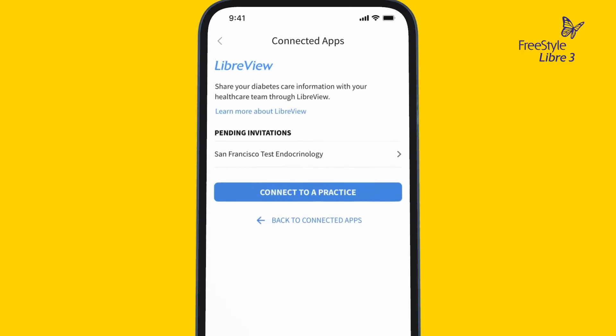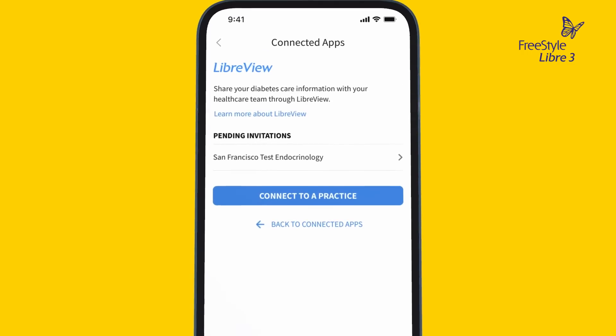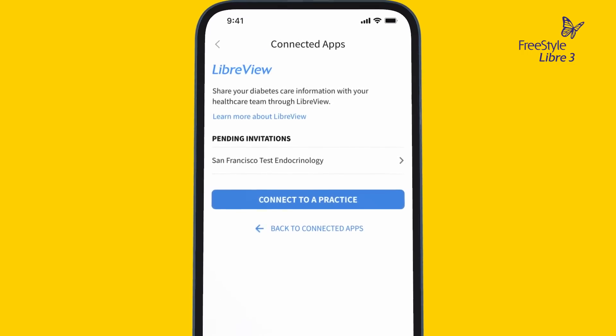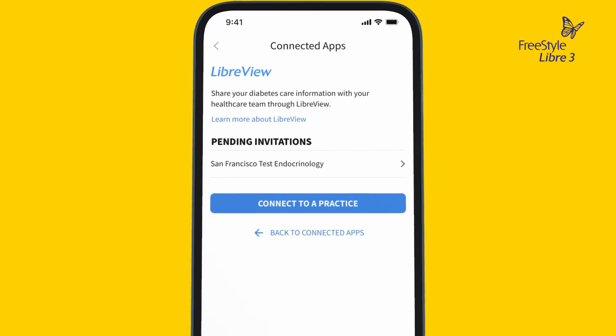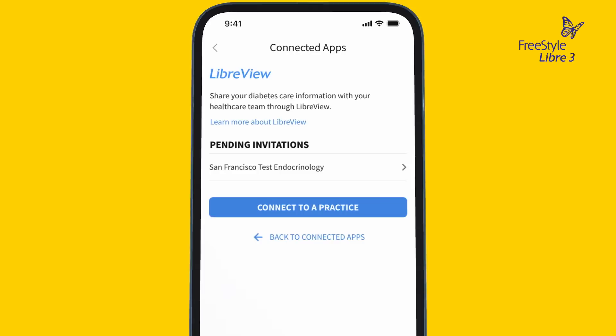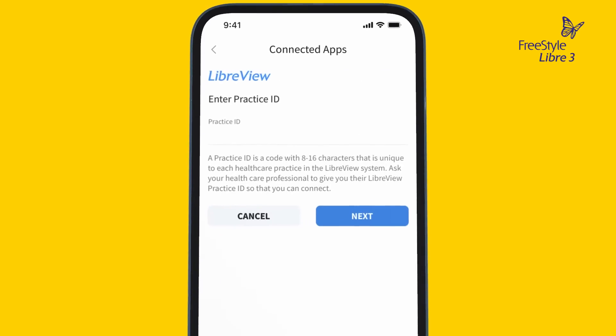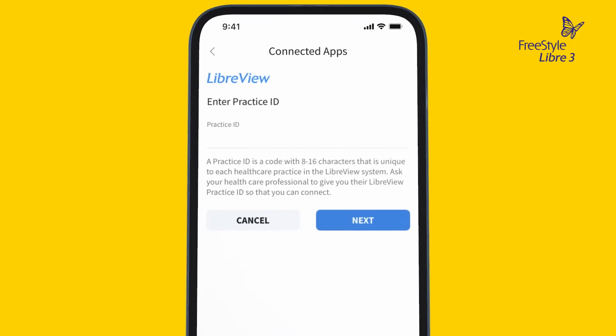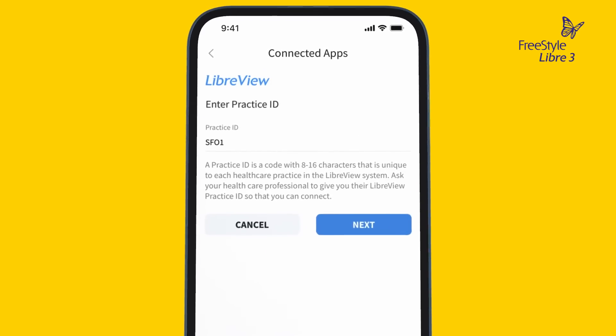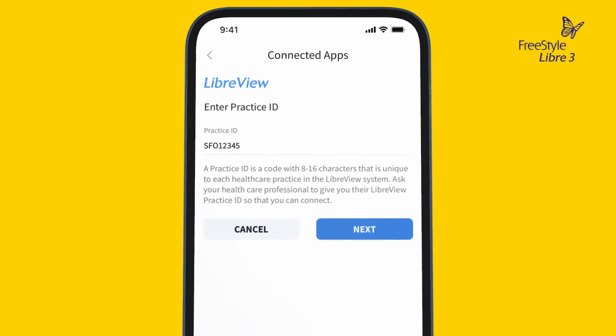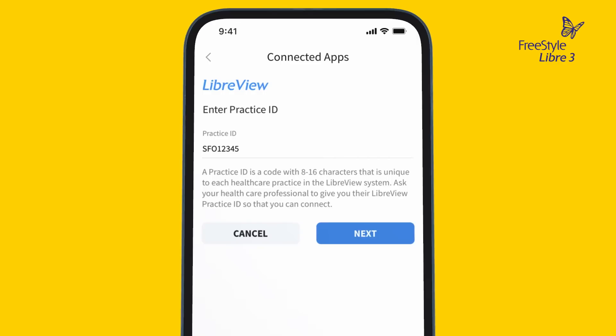If your doctor used your email address to invite you, you will see a pending invitation. If your doctor shared their practice ID with you, you will input it here. Follow the prompts to complete setup.